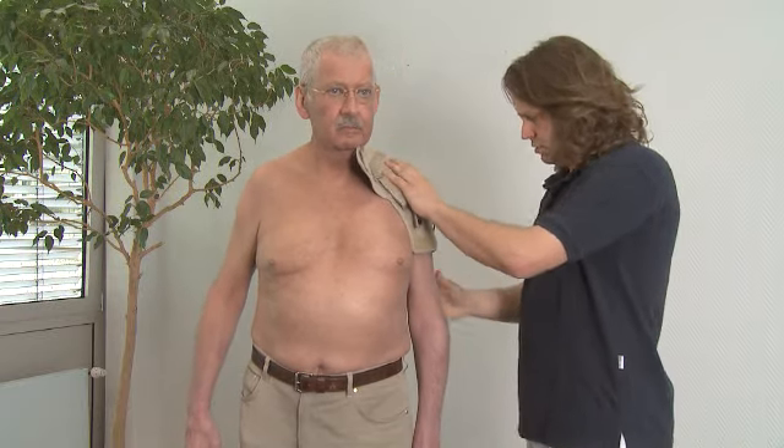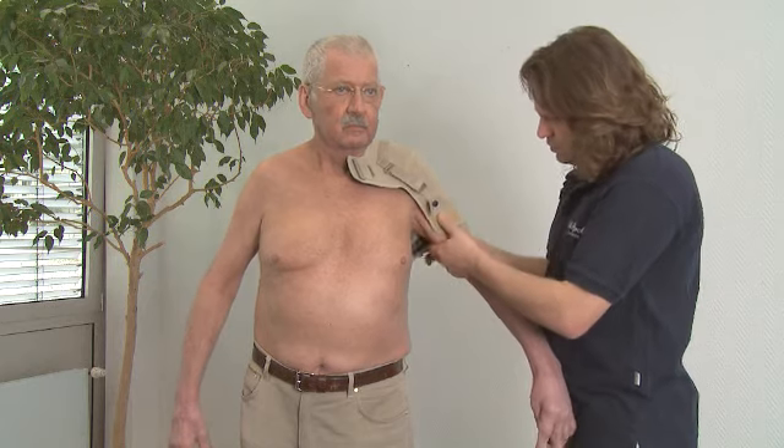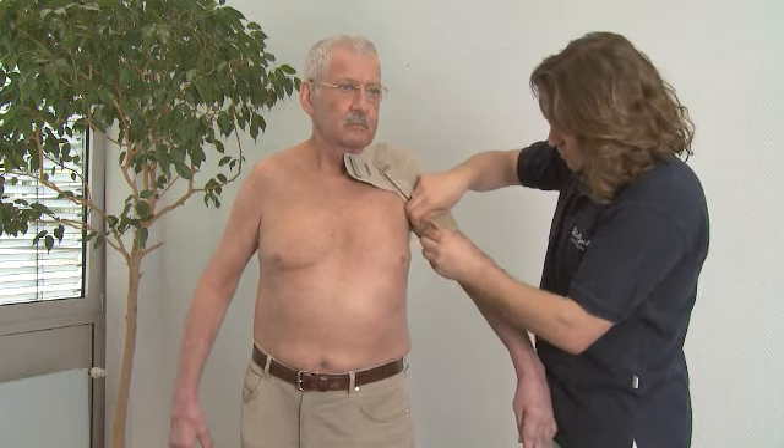First apply the shoulder part. Make sure it is well fitted to the shoulder and gently close the velcro on the upper arm.